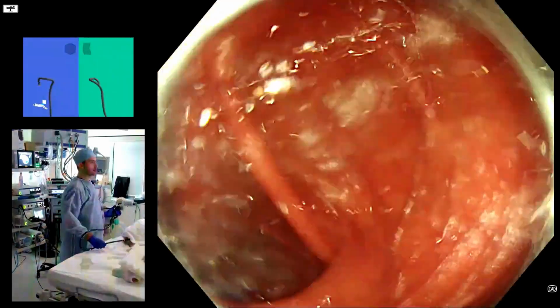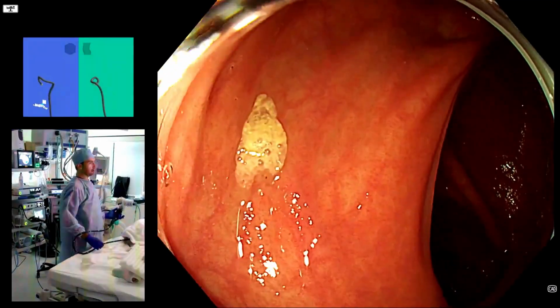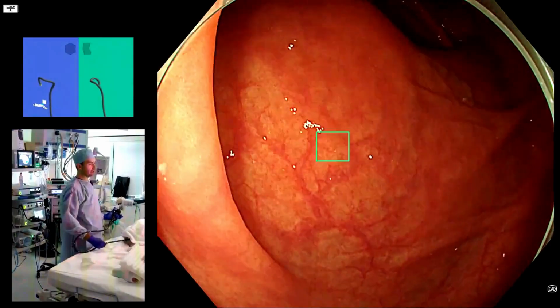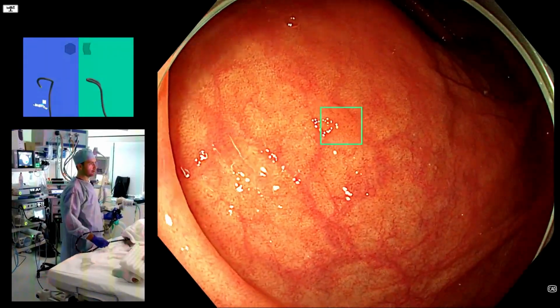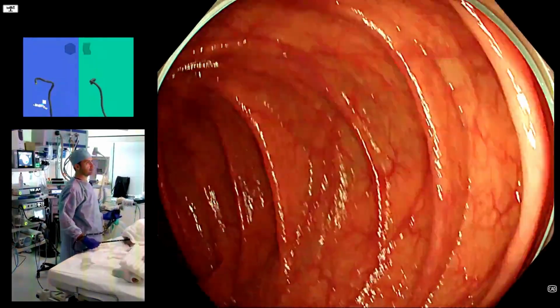And now we're going to just show you what it looks like, this colon, when it's properly distended and when we're really looking behind the folds. So the first thing to say is again that serrated lesion with stool on it is not detected reliably. So you must think about that. But look, one more lesion that we found. We keep on inflating and we keep on looking behind folds. I think we might find some more.